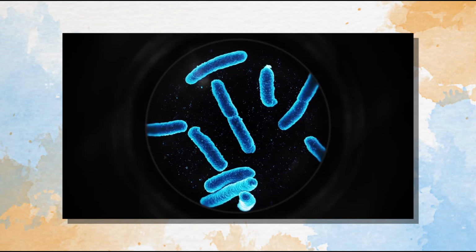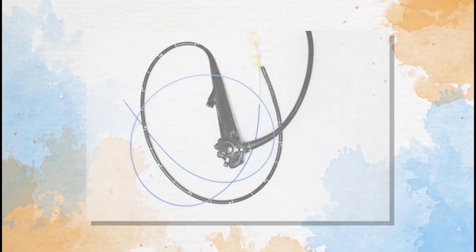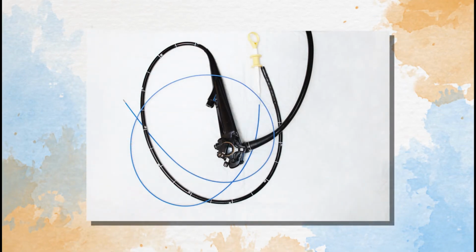The autoclave is not the only way to ensure sterilization of equipment or instruments, and in fact can damage some temperature-sensitive equipment. Those such as hydrogen peroxide will likely be covered in another video, but today we're discussing the steam autoclave.